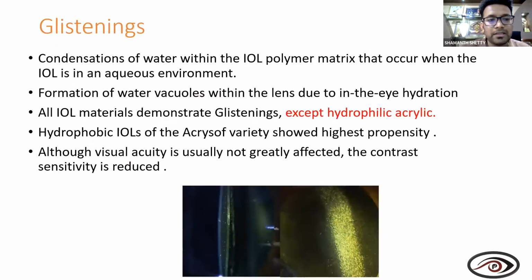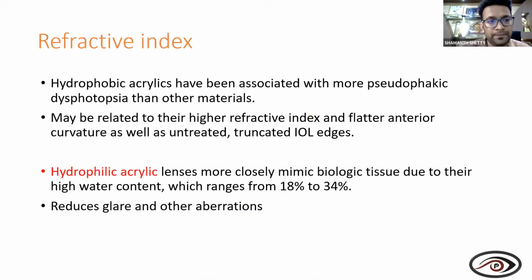Glistenings is nothing but the condensation of water within the IOL polymer matrix, which occurs when the IOL is in the aqueous. Basically, all the IOL materials demonstrate glistening other than the hydrophilic ones. Here, your vision is not compromised, but your contrast sensitivity is reduced.